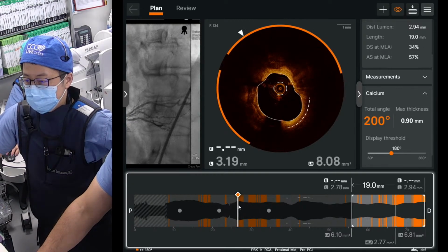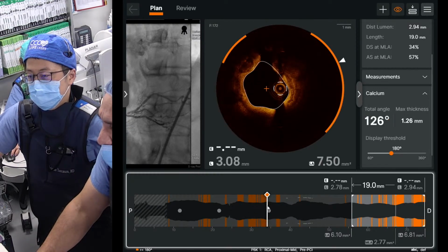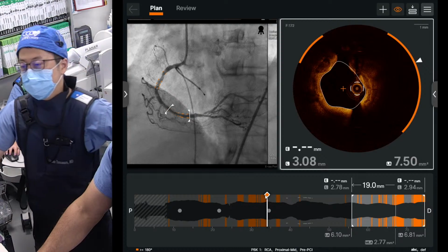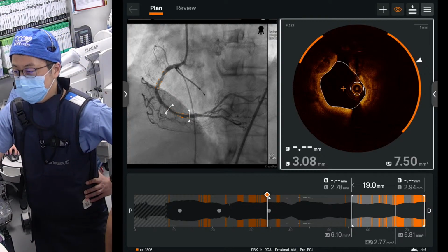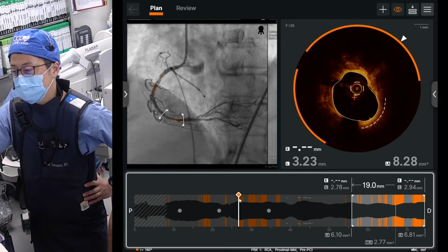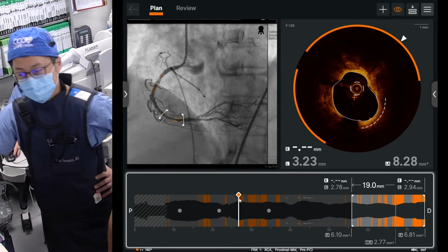But then look at your calcium thickness, which we never included. But if it is thick calcium, would that include? The point is, this is after the rotor. Yeah, but you're correct. Even after the rotor, we still have some 180 and thicker than the 0.5 millimeter calcium.